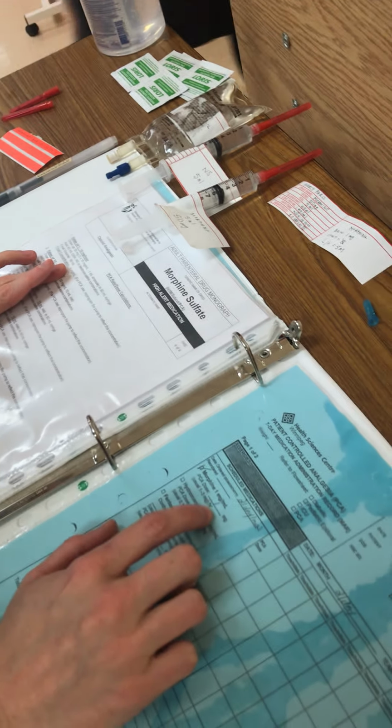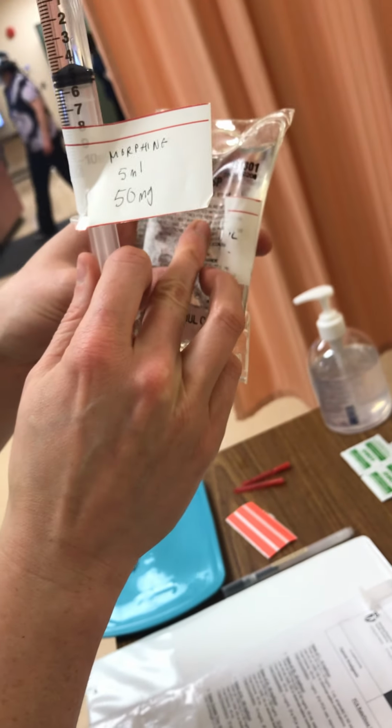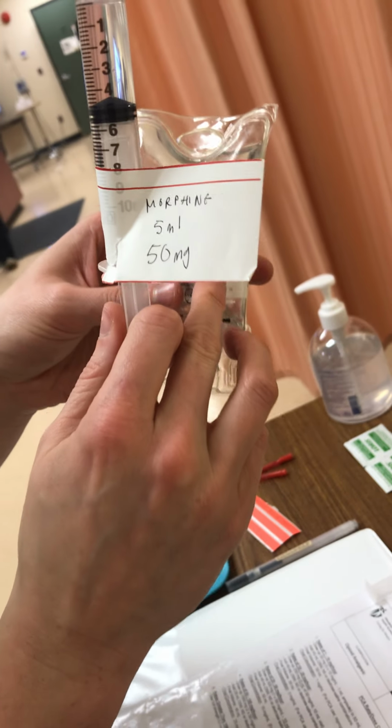So the right drug is finished. Now I'm looking at the right dose. My dose is going to be 1 milligram. Once I add the 5 milliliters to 50 milliliters, it's going to be 50 milligrams per 50 milliliters, which means the dose is going to be 1 milligram per milliliter, and that's correct based off the parenteral drug monograph, the MAR, and the medications. That also matches what I've written on my label right here.